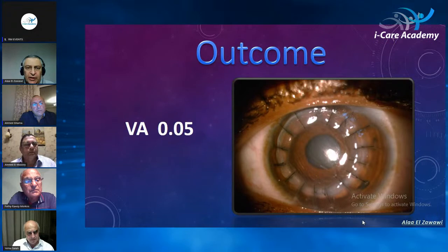And really, it's very challenging. Dr. Alaa, I presented a quadruple procedure in which I removed an anterior chamber IOL and I used the Flieringa ring. It was very nice. I could do a capsular access in such a condition. And I used the Flieringa ring to put iris hooks also. It was very helpful. That's okay, but you have noticed that there was an Argentina flag sign. There was a complete tear from up down for this rhexis.